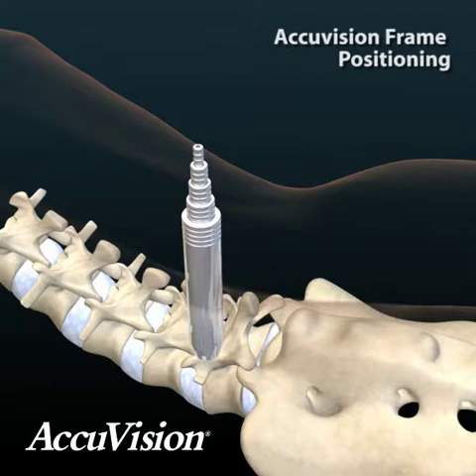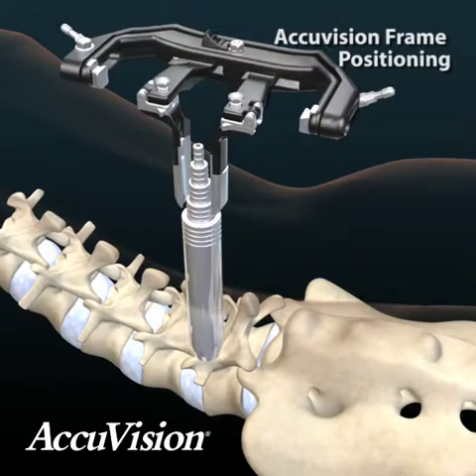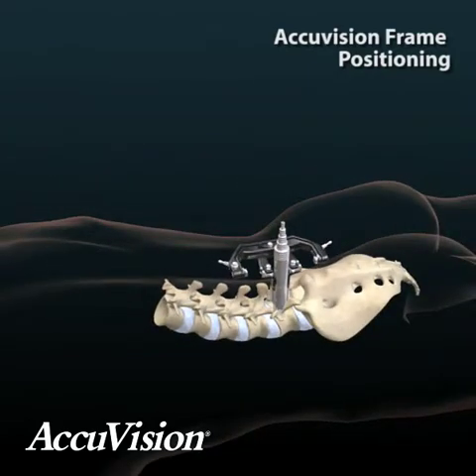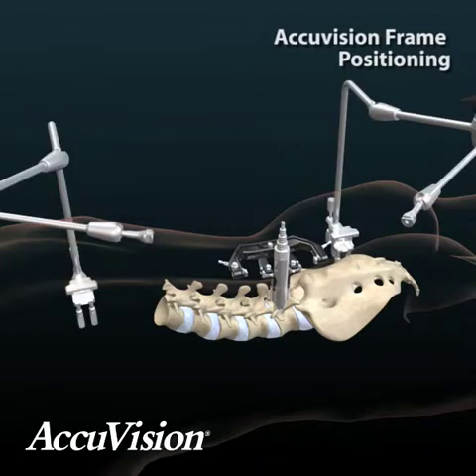With the blades in place, the frame is guided over the sequential dilators and docked onto the spine. Use fluoroscopic imaging to verify position. The frame can be placed with the open side facing medial or lateral to the surgical incision, depending on surgical preference.